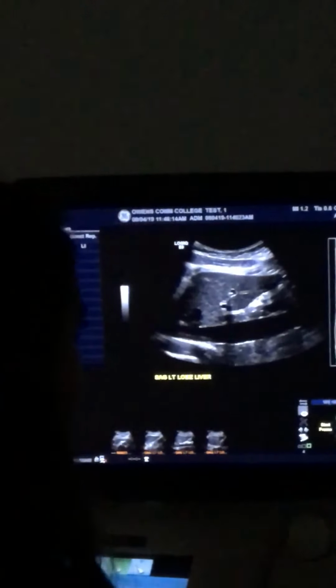After that, I'm into right lobe. So I actually didn't really move my probe at all. I just angled in between here in this little opening between the rib cage right here. So now we're gonna go to right lobe. If she was my patient, I would keep going here, here, here. So I would just keep going all in one fell swoop this way.